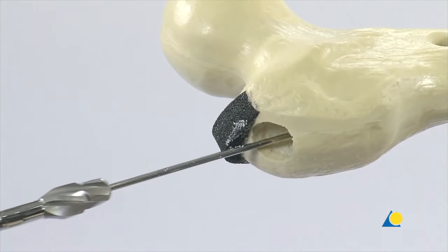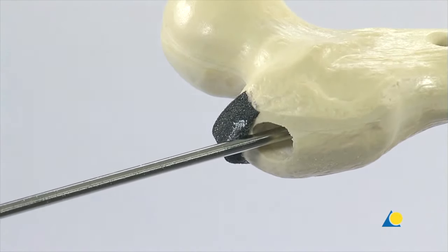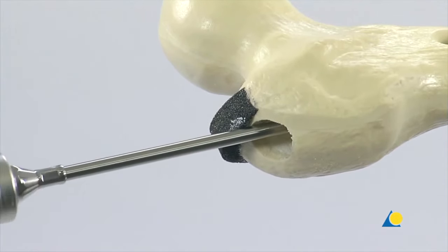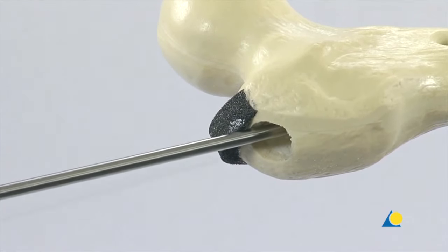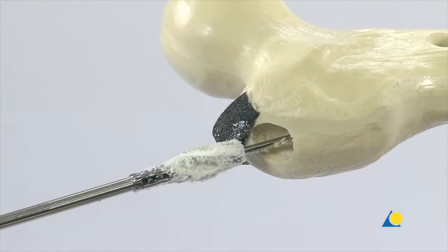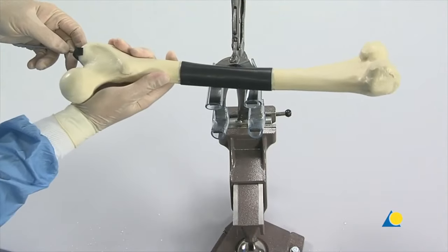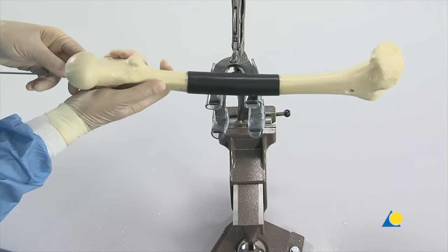Reaming is continued in 0.5mm increments until the desired diameter is obtained, usually 1mm greater than the diameter of the nail to be used. In this exercise, a 10mm nail is used so the medullary canal should be reamed to a diameter of 11mm. It may be useful to tap out any bone debris from the plastic model before starting the next step.